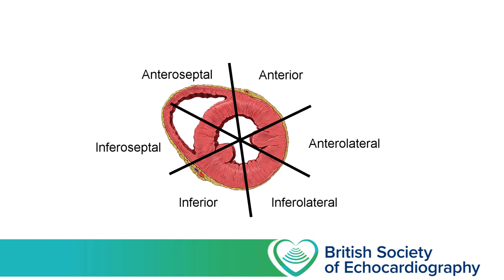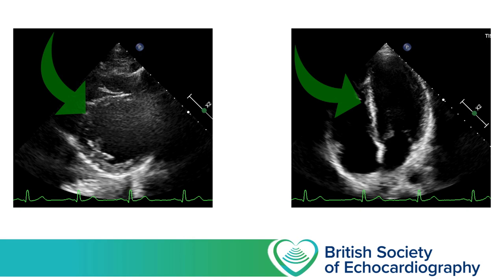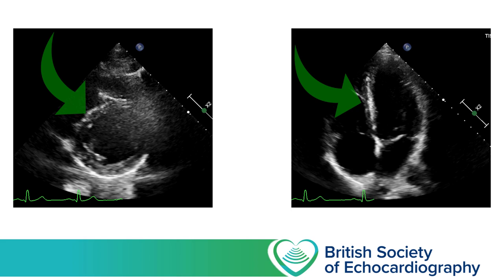At the base of the LV we use the same six divisions, while at the apex the septum and lateral walls are not divided, giving only four apical segments: septal, anterior, lateral, and inferior. It's possible for the same segments to be seen in multiple windows. Here you can see a parasternal short axis view and an apical four-chamber view from the same patient, with the arrow highlighting the mid-infero-septal wall in both cases.